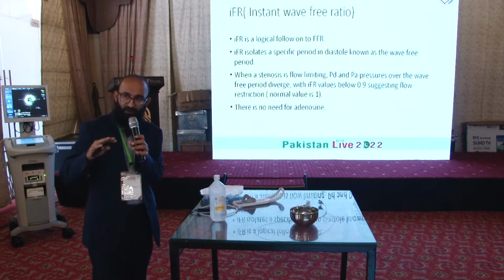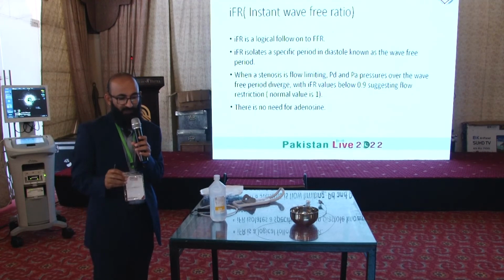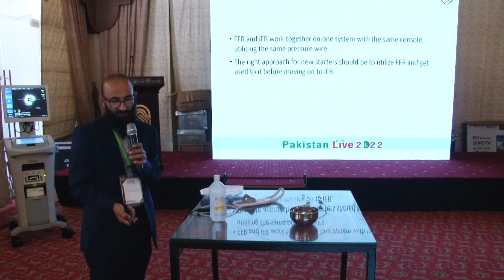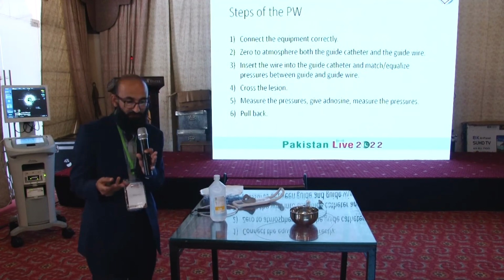You don't need to have any gradient across that. But if there is significant stenosis, there is a gradient. So there is no need to give adenosine, and it's very easy. So we have a case. I will go to that. And these are the steps of how to do it.